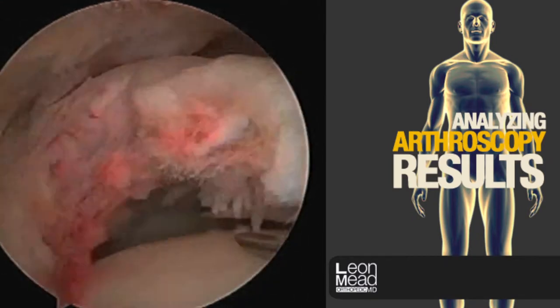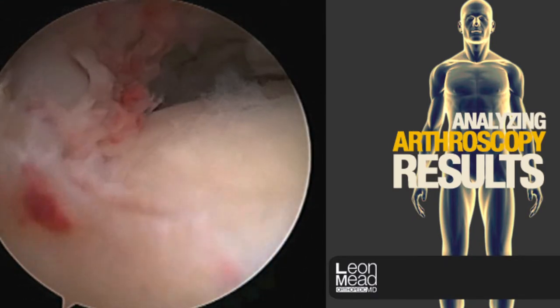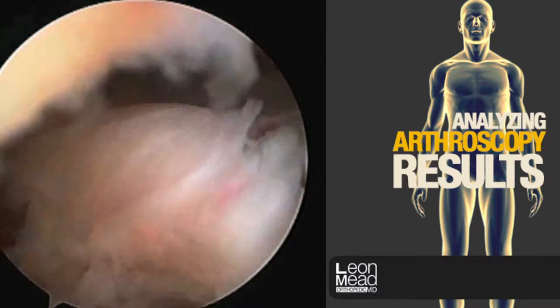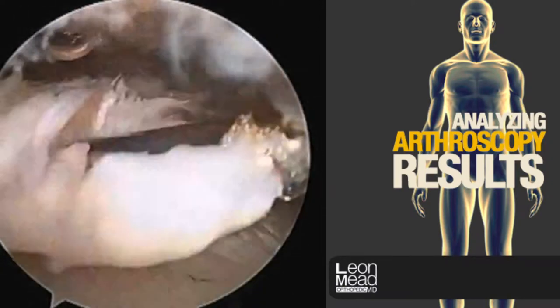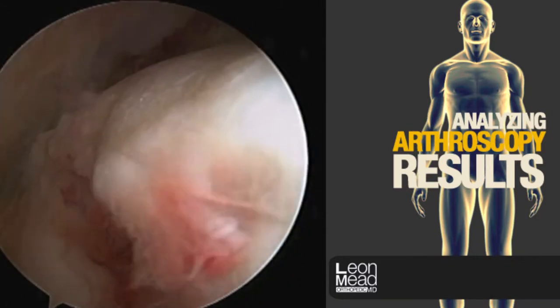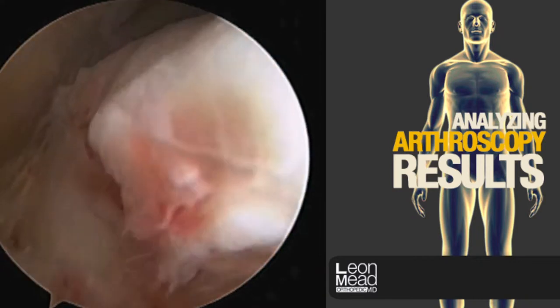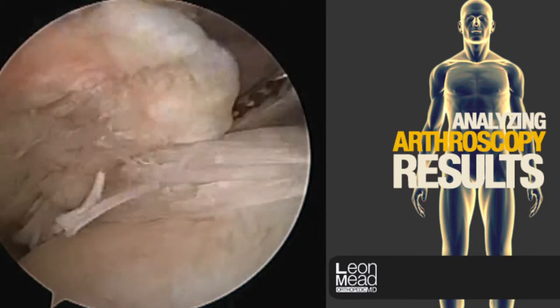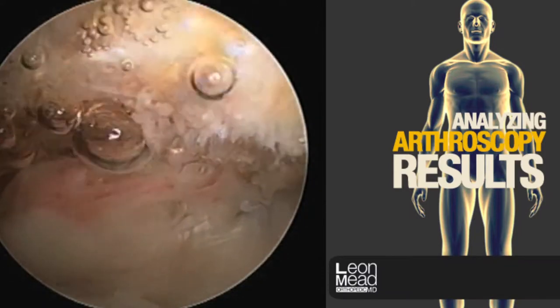The cuff is this large segment of tissue that we are grasping at this point. This is showing where it belongs. As you can see, when it is left without tension, it tends to retract away. That is why rotator cuff tears cannot possibly heal on their own — it requires surgical intervention to do so.